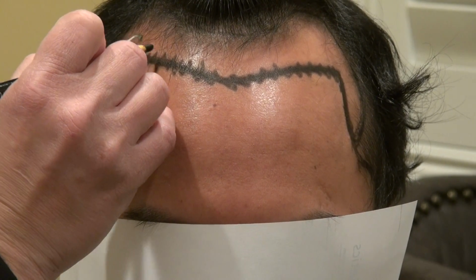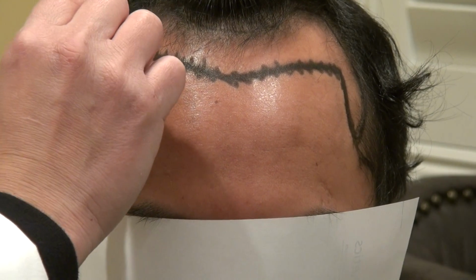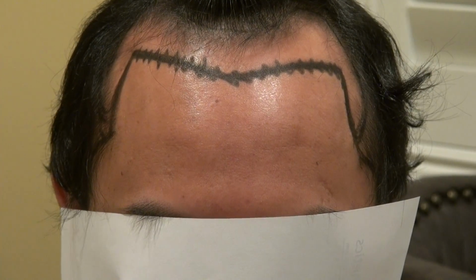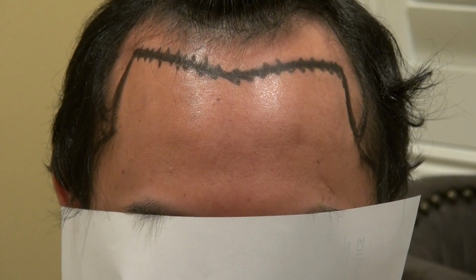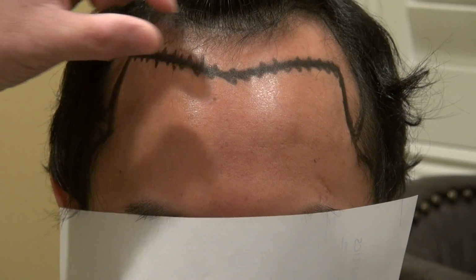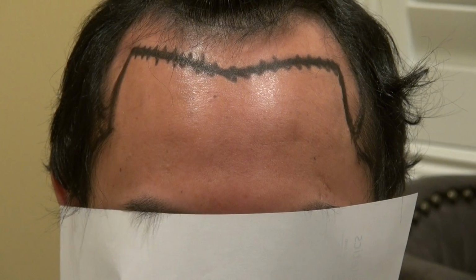With a tighter hairline, we use a smaller zigzag, and right behind it you have thicker roots, 2 hair, 3 hair right there. So it will look very sharp and very dense, because there are fewer single hair roots in the front, but there are a lot of roots that grow 2, 3 hair right behind it.